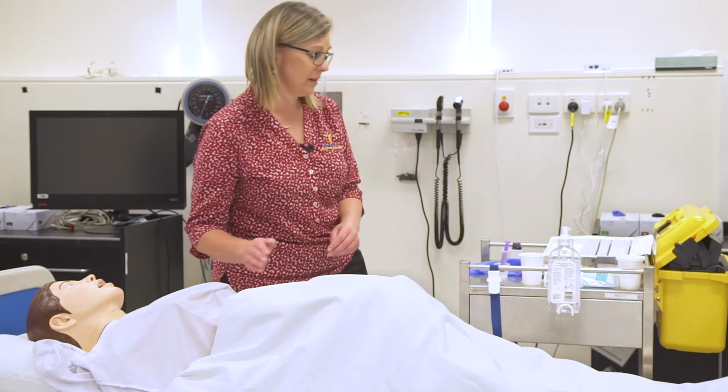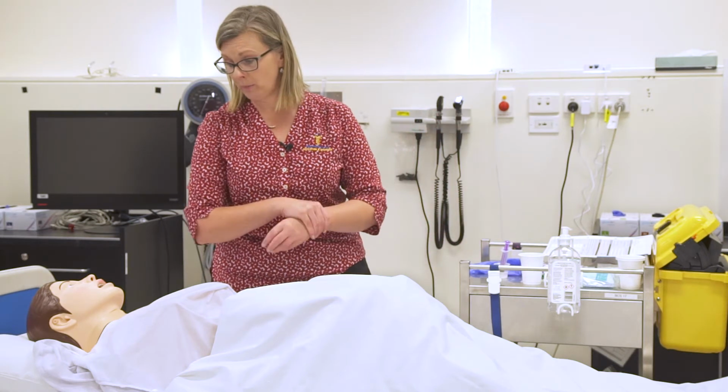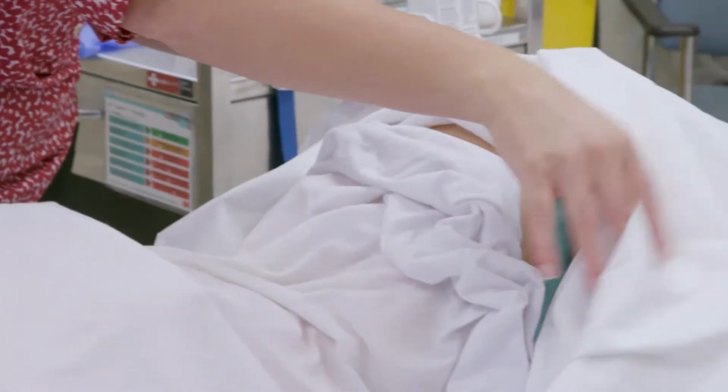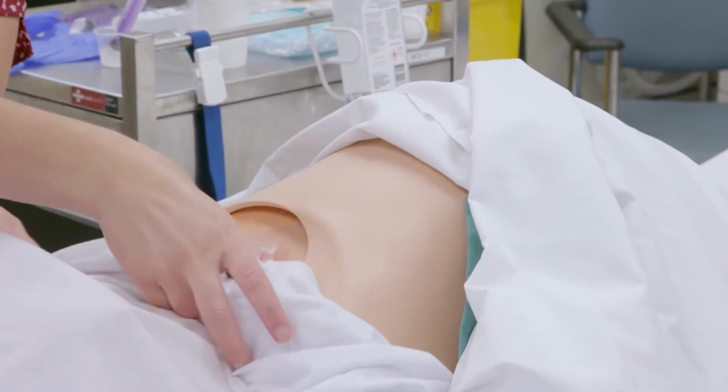We'd have a look at her site, but it's important to use your hand hygiene at this point, and you'd use your alcohol-based rub for a good 20 seconds. Okay. Having a look at the site. Expose Mary, let her know constantly what you're up to. Mary, I'm just going to have a look at your site.